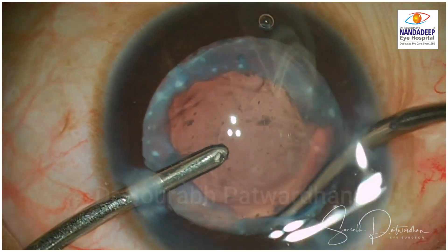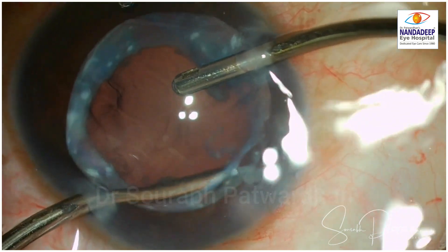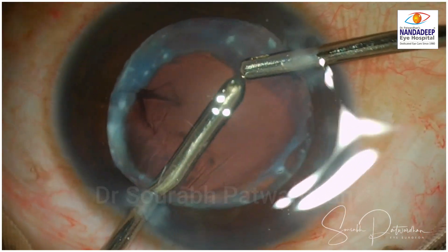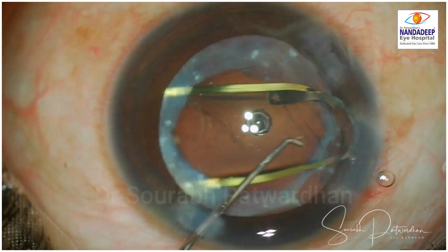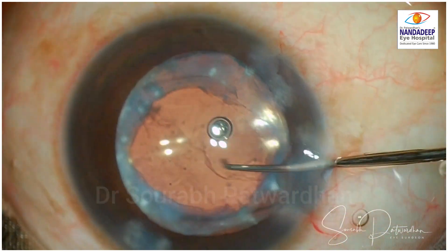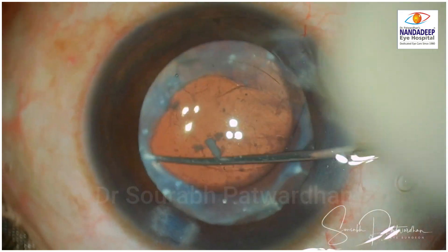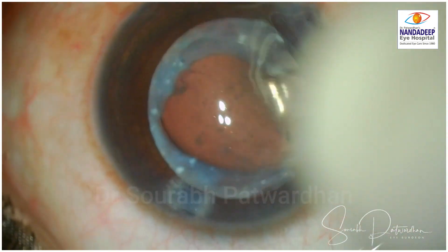Here I am using irrigation rather than aspiration to tease that sticky cortex out. It is always safer because you are not actively aspirating — you can use a little bit of force. With aspiration you can catch hold of the posterior capsule or peripheral capsule and cause dialysis or a tear. So in these cases it is a good idea to use the irrigation cannula and use the force of the fluid to tease out those loose particles or cortical elements.